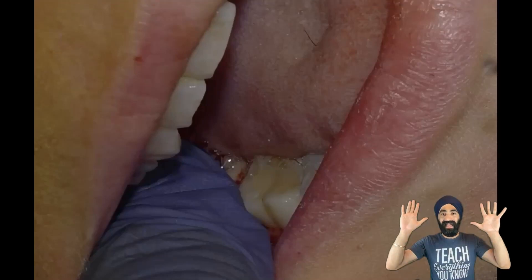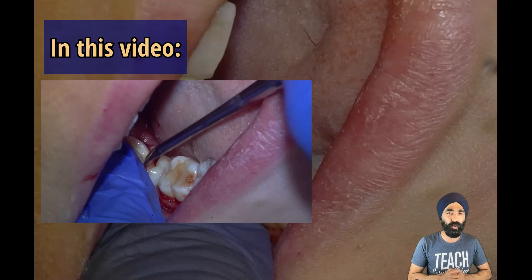In this video I'm going to share with you how I extracted this disto-angular wisdom tooth with very curvy roots, running into some difficulty and how I overcame that.